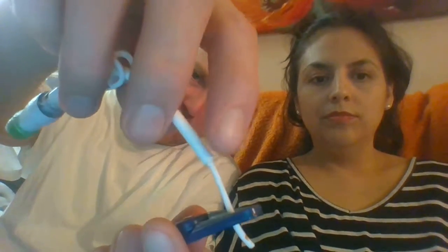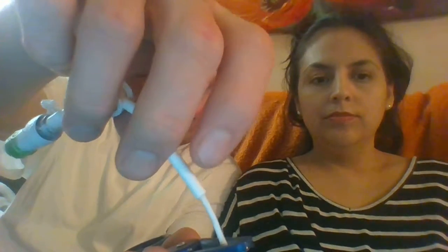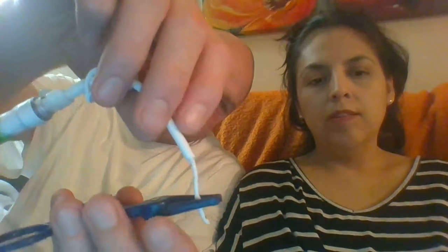So when we noticed that there was fluid leaking, we tried to determine where the break in the line was, where the fluid was coming from. We took our emergency clamps and clamped the line just below the break point, which we found was right here, just beneath where the thick part of the line joins with the thin part of the line. I don't think you can see it here in the video, but it's right there in that area. So we clamped below that point to prevent anything from getting inside of her central line that may cause infection.